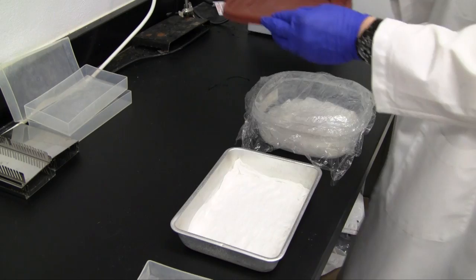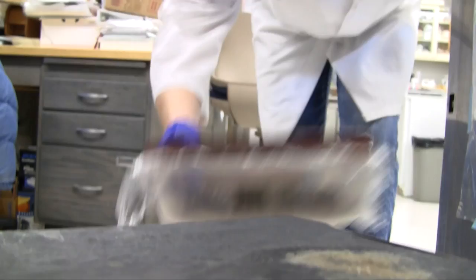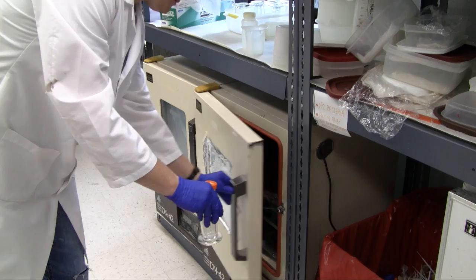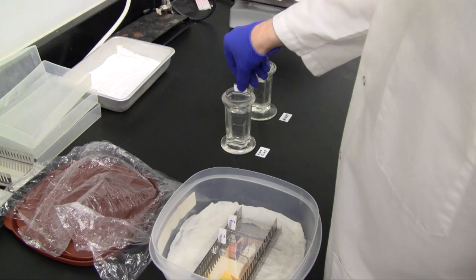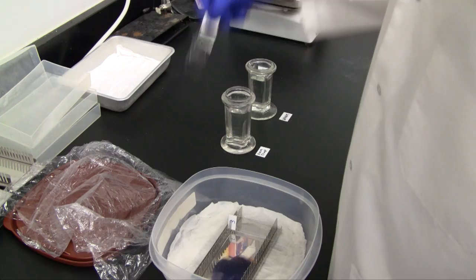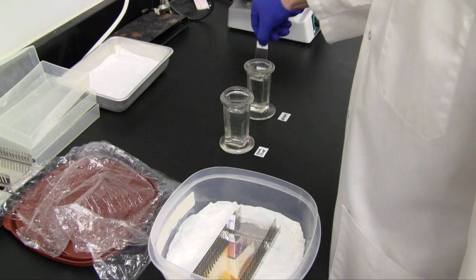The humid chamber, a Coplin jar, and 50 milliliters of 2x SSC are then placed in a 55 degrees Celsius oven overnight. The next morning, a second Coplin jar is filled with room temperature 2x SSC and put next to the pre-warmed one, now filled with the warm 2x SSC. The slides are dipped into room temperature 2x SSC to remove the cover slip, then placed into the warmed 2x SSC for approximately 20 minutes.